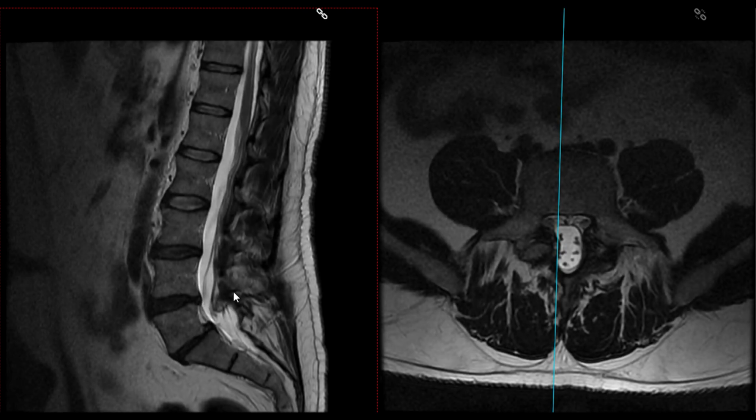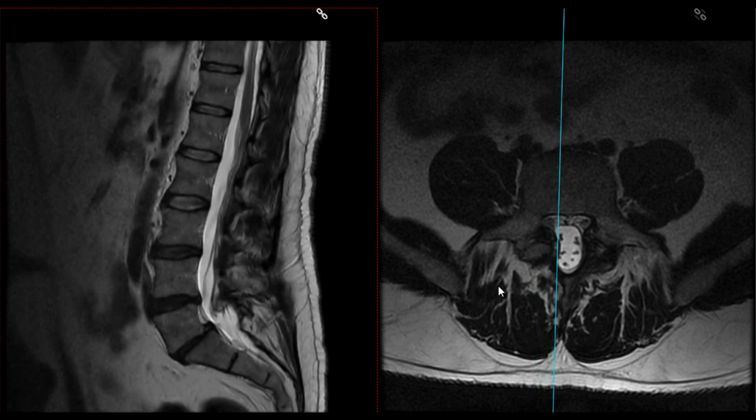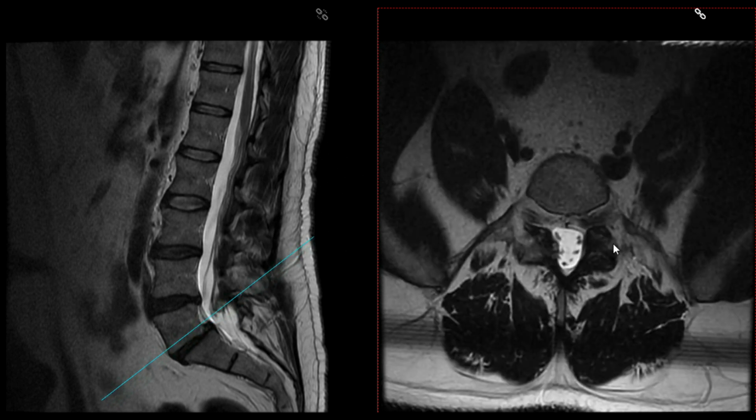So we'll move forward through the MRI here. Look at this area of bony protrusion here at the facet joint. And so I'll scroll through the sagittal. You'll see that he does have stenotic foramen at the L5S1 level. And so you wonder, is this going to be the issue? But patient doesn't have any pain on the left side.